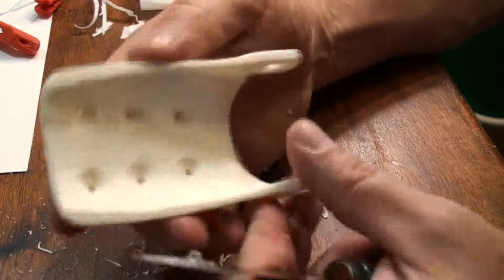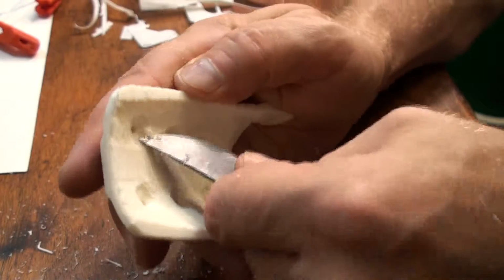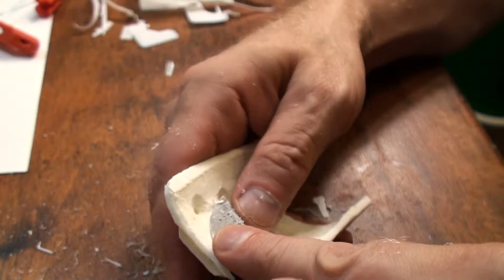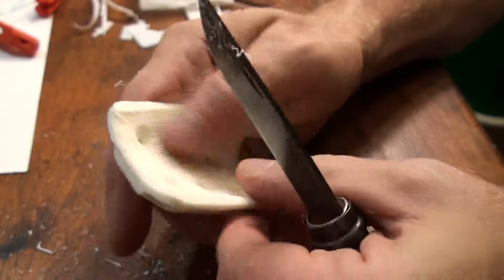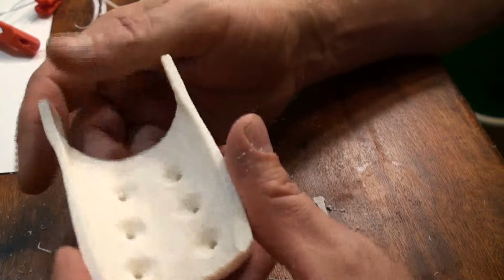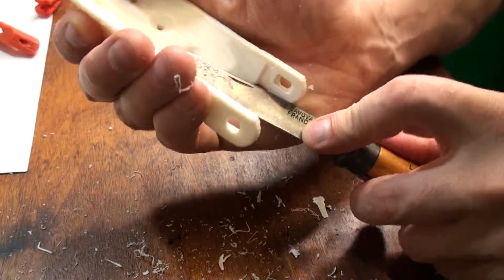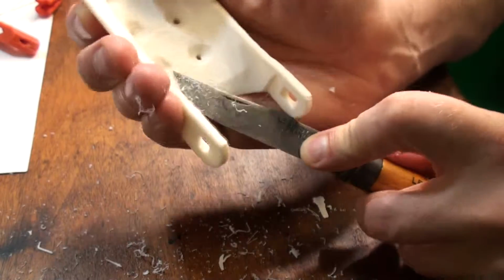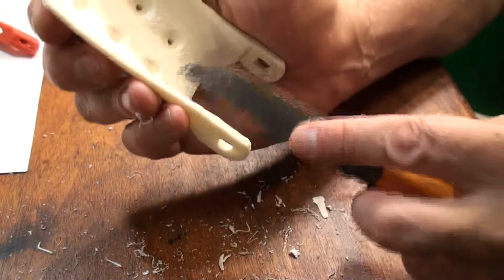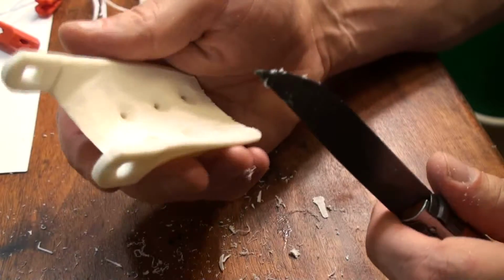Well, if you don't print with a brim, then most of that you won't have to do. I only suggest a brim if you're printing ABS. PLA, you won't need it. With PLA, just print the model just like it is, with no support, because it comes with its own built-in support. So, like the instructions say, your slicer settings should say no support.